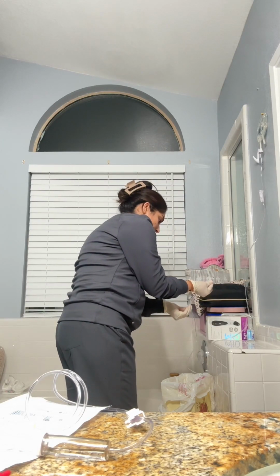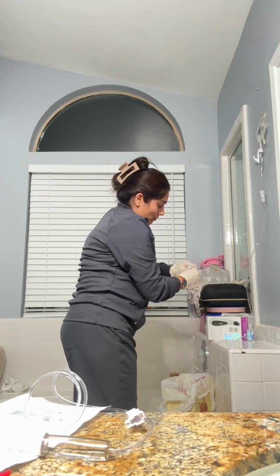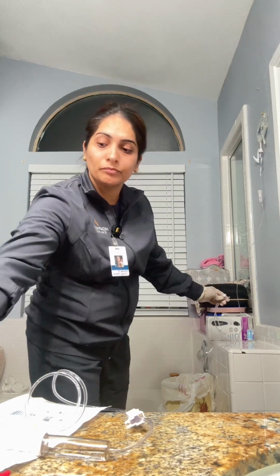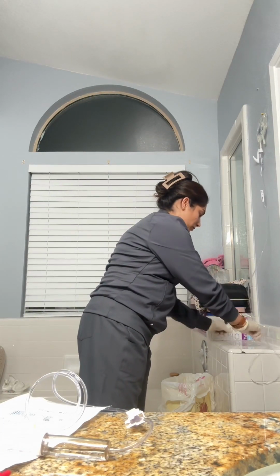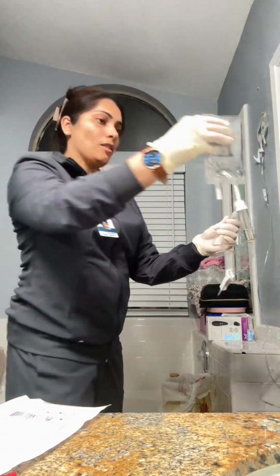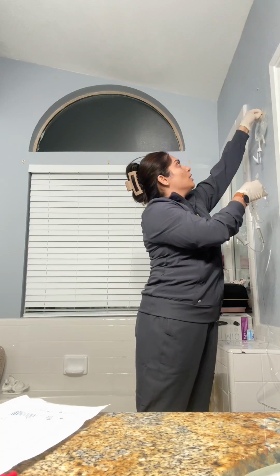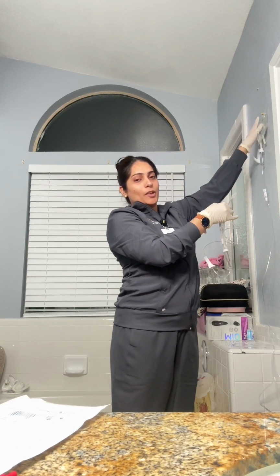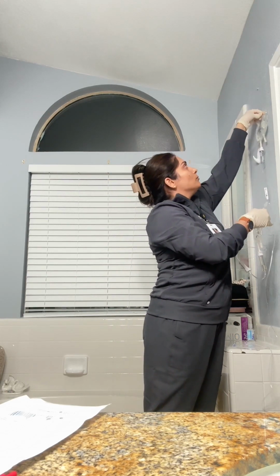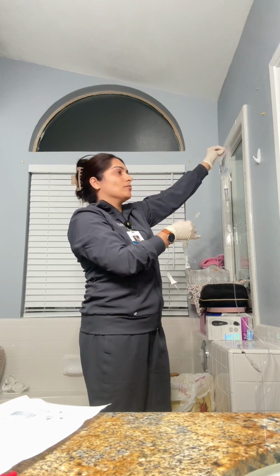And we are going to cover our adapter right here. And this IV, the medication, because it's a secondary, will go above, hanging 30 inches above the patient.